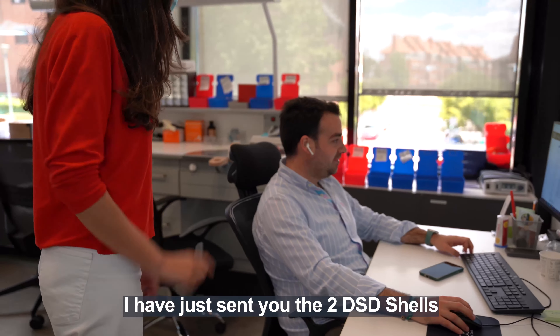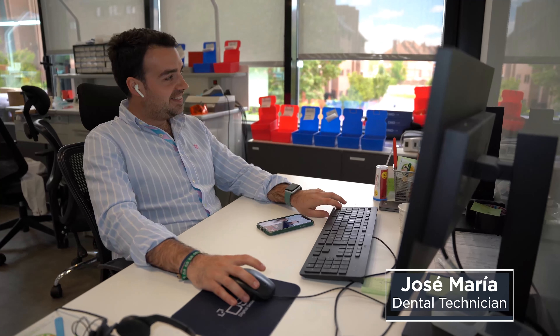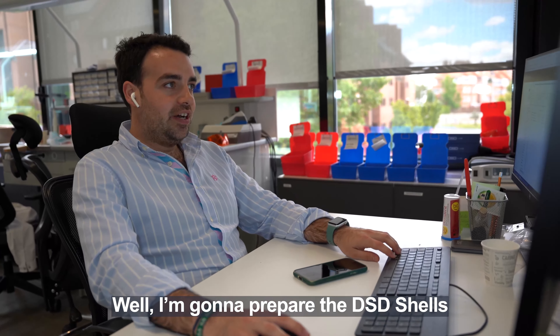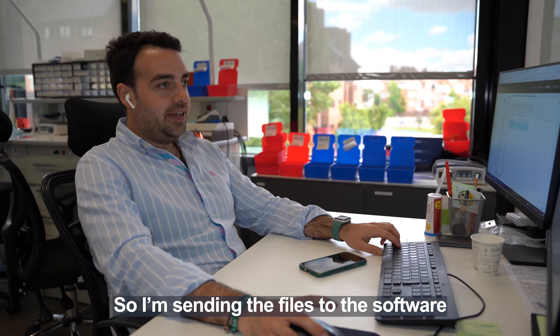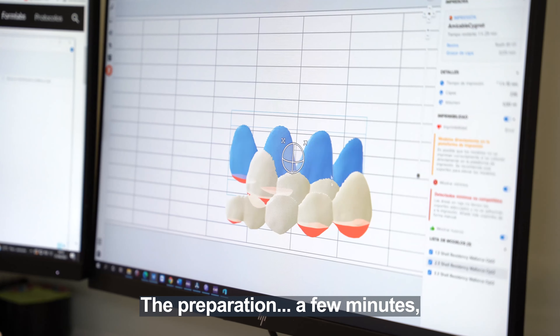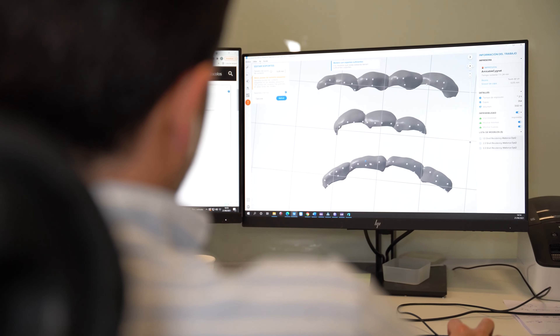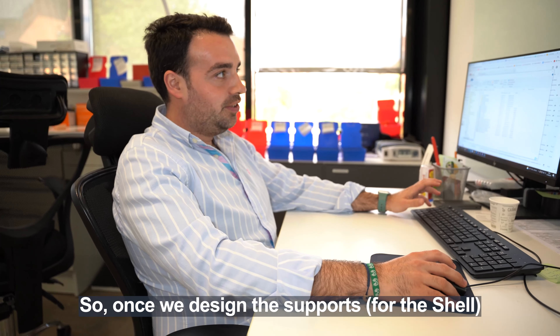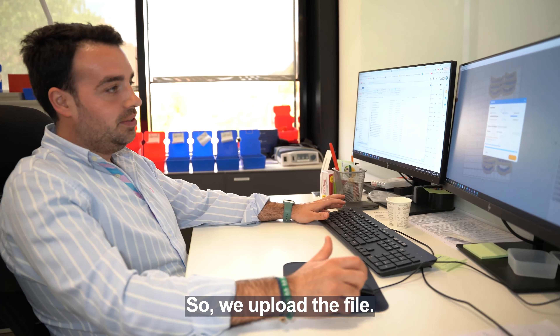We have sent you the two shells and the two motivationals to print. I'm preparing the shells for the Residency and placing them digitally in PreForm to start printing. It takes a few minutes for preparation and about two hours for printing. Once the supports are generated, we send it to the printer and load the job.